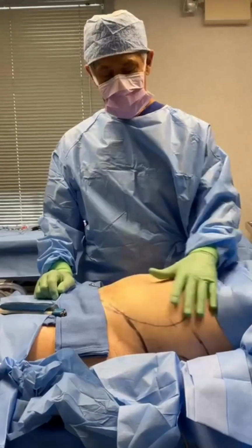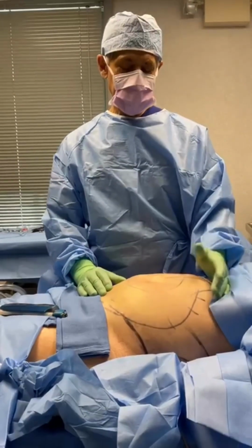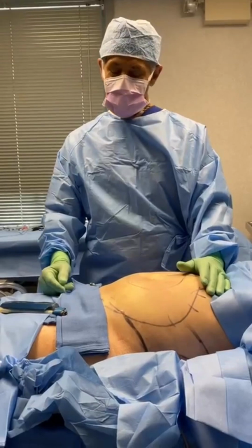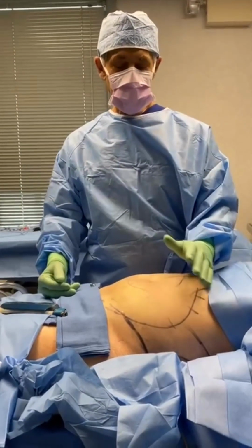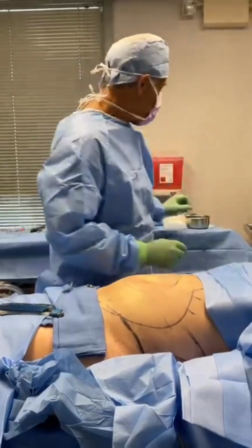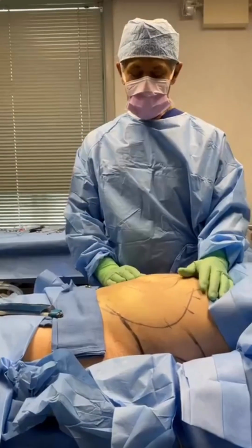And the abdomen's numbed up. Today's project is permanent removal of fat from our patient's abdomen, waist, and then onto the back side, the lower back, the hips. And in addition to sucking some fat out, we're also going to give a Renuvion plasma energy tightening treatment to the abdomen. We're able to accomplish this permanent fat removal using what's called tumescent local anesthesia.